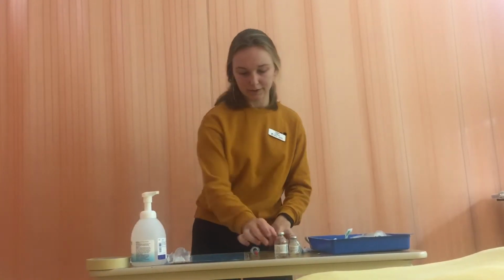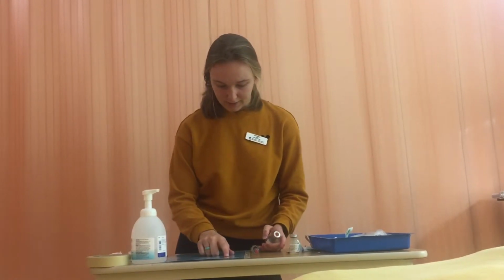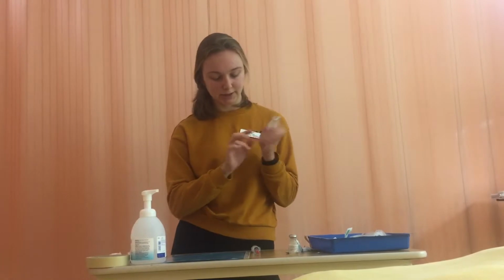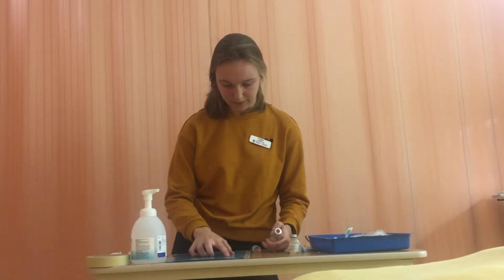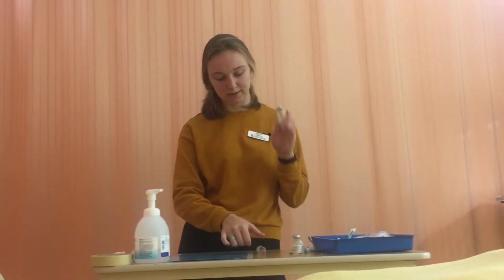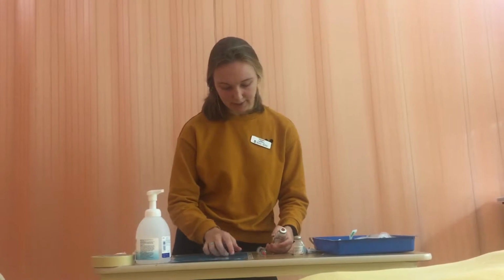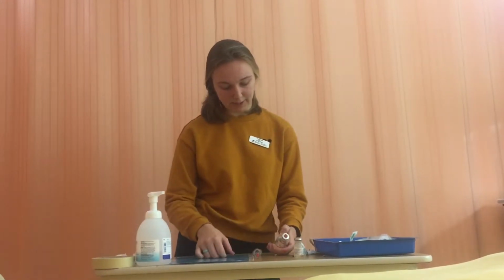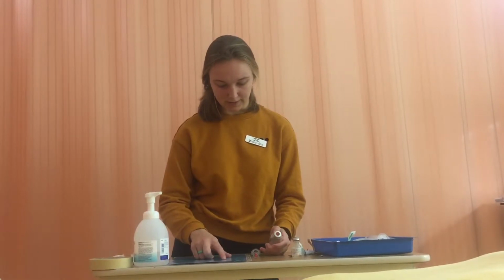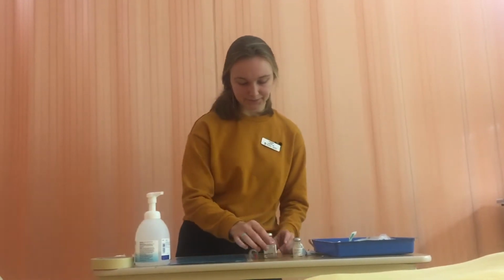But first I'm going to do my third check. So we have the right patient, Emma Wrightson. The right medication is Penicillin G. We have Penicillin G in here, and we have the Penicillin G Sodium vial. We have 3 million units, which is 6 milliliters. We have 6 milliliters in the syringe, and this was a 5 million unit vial, so we know we have the right dose. The right route is IV. We're going to be giving this via mini bag, and this says IV use only, and the right time to give it is now, every 4 hours, and she hasn't gotten it yet, so we know that's the right time.